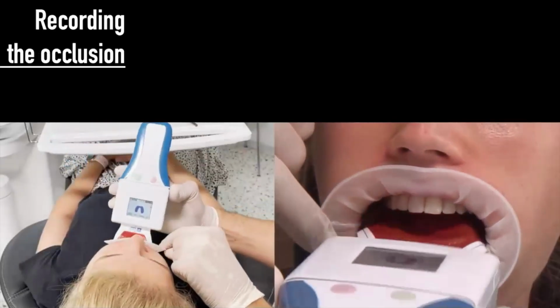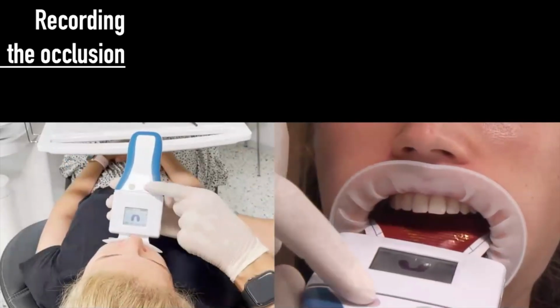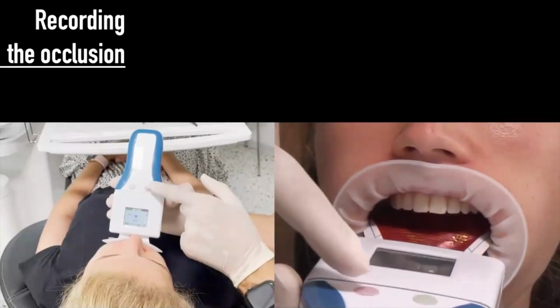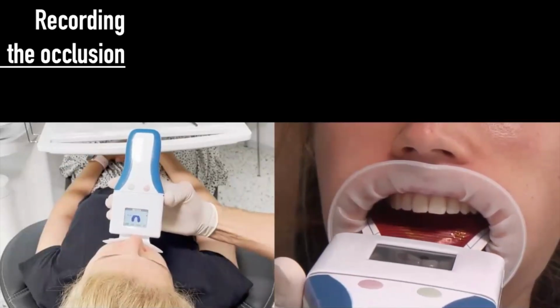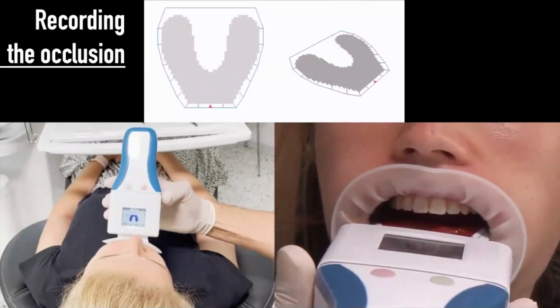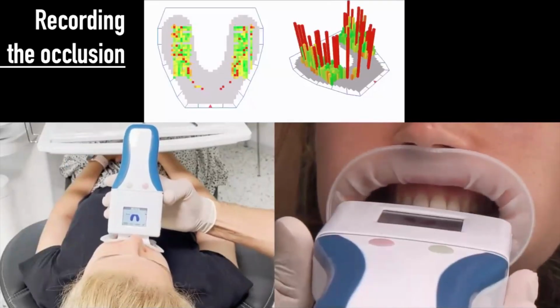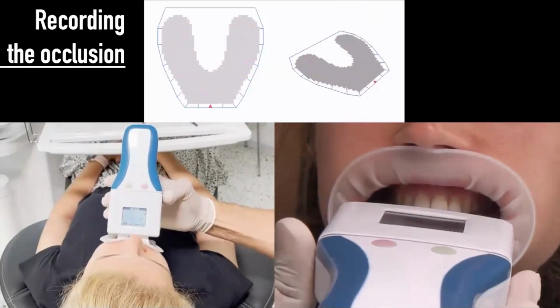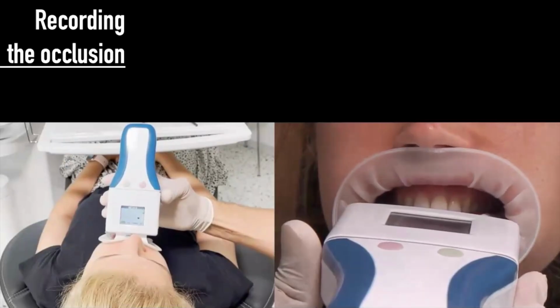Here you see a clinical example of a patient measured with OccluSense. The sensor is inserted, not exactly parallel, but a little bit shifted into the patient's mouth. And then you instruct them to conduct any movement that you would like to have recorded.